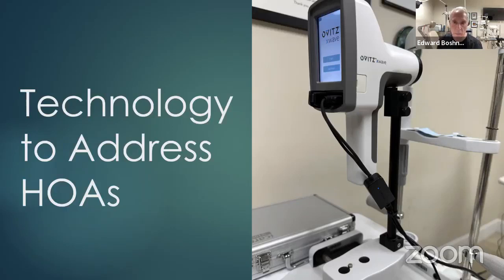So we take images of a lens. We send the images with the HOA readings to a laboratory associated with the University of Rochester, New York. They take that information and send it to the lab. The lab in this case is iPrint, and they embed that into the optics of a scleral lens. So we call that kind of lens a wavefront design scleral lens.